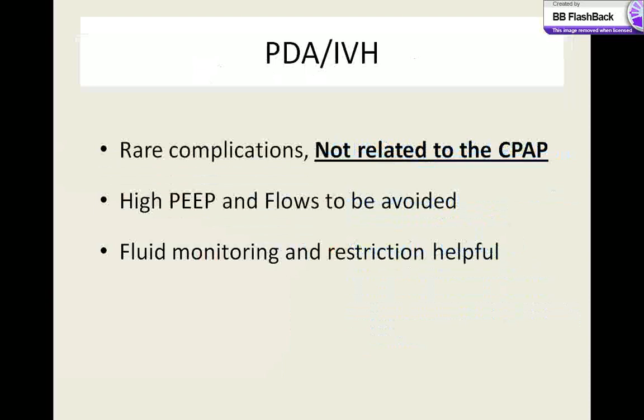Complications like PDA or IVH are not related if CPAP is used in permissible range, that too within 5 to 8 cm of water.